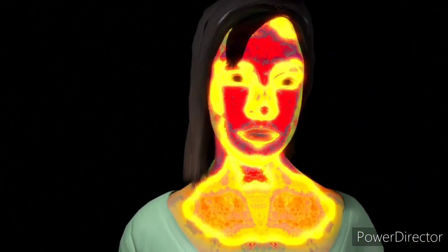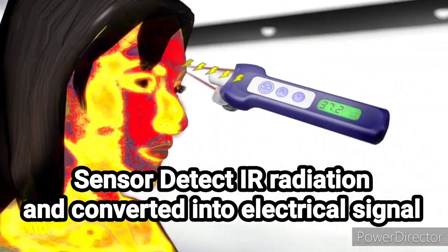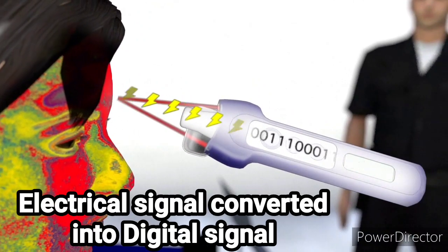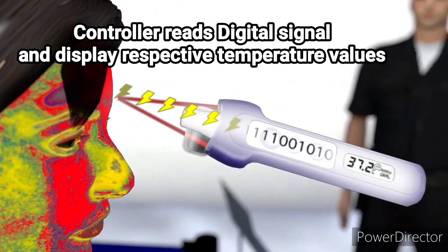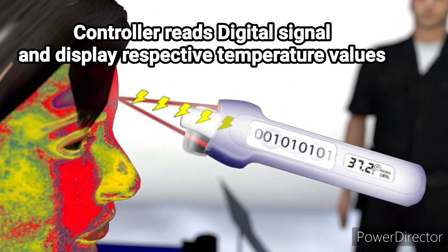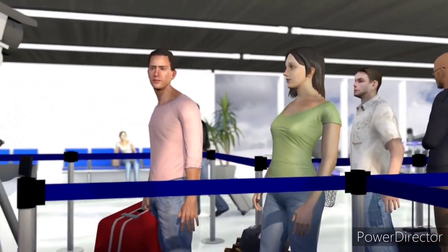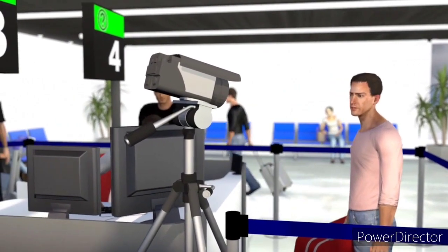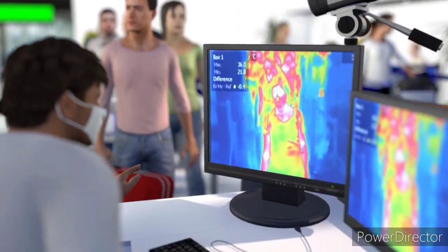This sensor will detect IR radiation, which means it produces an electrical signal output. The electrical signal will be converted into digital format, then binary format. The controller will read it and display the temperature value on the display. This sensor will detect the temperature value and display it.